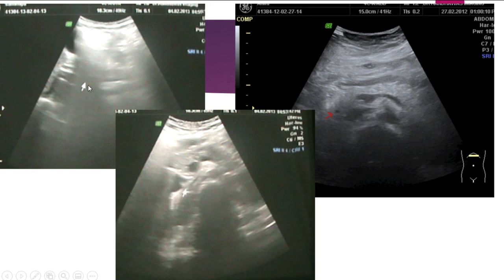And when it is difficult, as I told you previously also, find out the proximal part and find out the distal part. Both of them appear normal. Usually the CBD is normal. Now here you can see the distal part at the level of the pancreas. You can see this pancreas, the portosplenic vein, and here you can see a small round area in the lower part of the head of the pancreas.